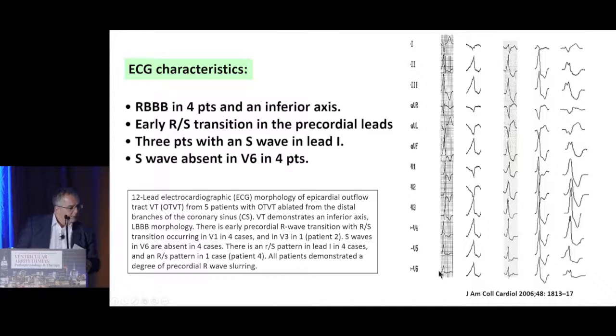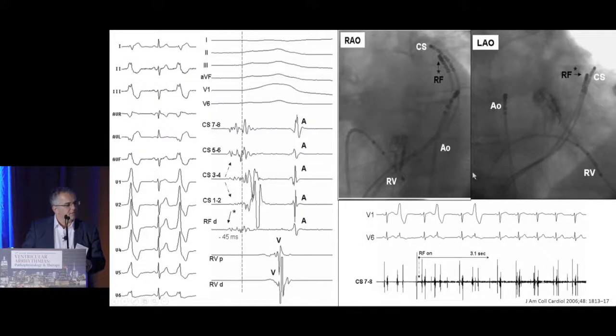Back in 2006, we described some distal CS PVCs and VTs, and as you can see here, when you look at the electrocardiogram, most of them do have a tall R in V1, but in one of these patients here, this is potentially a typical LV summit electrocardiogram. There are some details there, but this is what you typically see coming from that region.